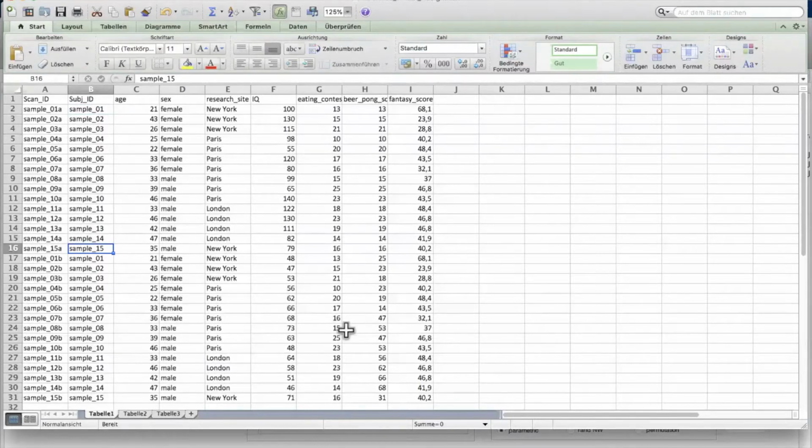So then those variables that you see here are basically similar to the ones when you do not have any within subject design, but obviously some things like sex or group would have to be repeated, right? So sample 1 is a female one, and then at time point 2, this wouldn't change. It's again a female one. And if you have maybe acquired the data within the same year, just a couple of weeks later, then the age also wouldn't change. For example, research site would also be the same, so this is repeating, but you could also then enter some variables, for example, like IQ, and you do an intervention giving some kind of drug or deep brain stimulation or some training for intelligence or whatsoever. Then you could also have the change of this respective variable, which we'll analyze later on, given in here.